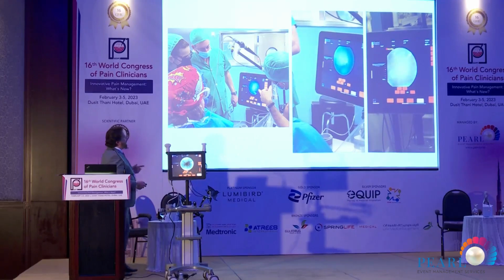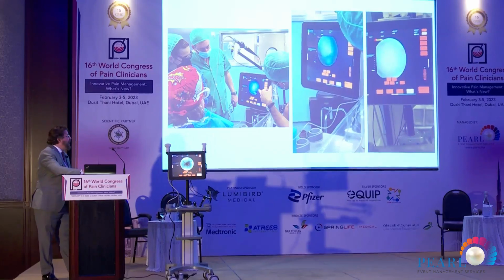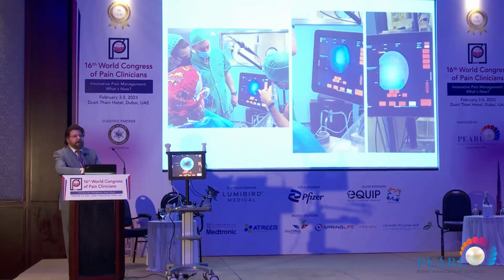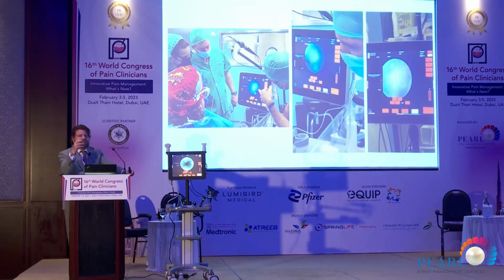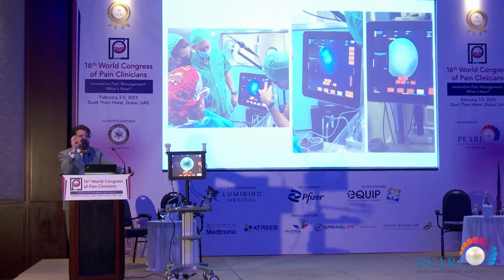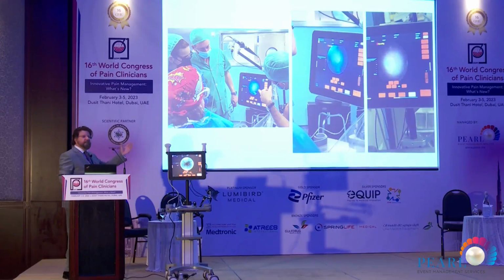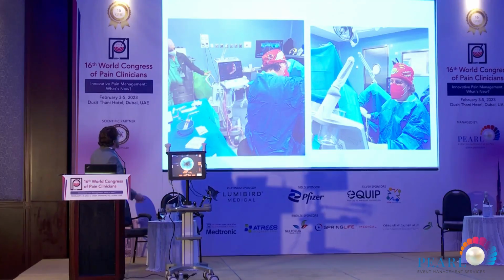I compare this and improve this with advanced ultrasound, with three-dimensional study and with elastography. Quantitative elastography is good for us because it's important to measure the degree of deformation or elasticity in the muscle, because sometimes you don't have collapse of the Alcock canal, you have hypertone of muscle. This is more important, because you put Botox and maybe you perform one hydrodissection and you obtain the best result for the patient, and the patients are very happy with this treatment.